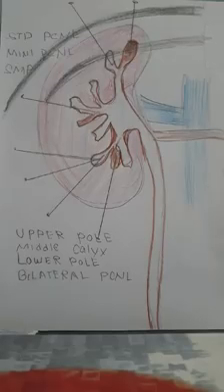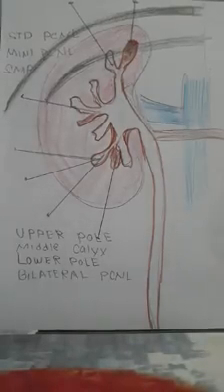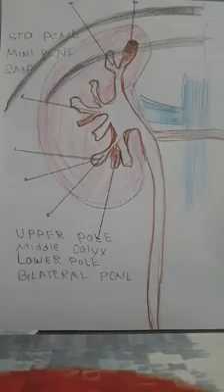I used to do standard PCNL when I was training. We used to use a 26 French scope and a 28 or 30 French sheath. Eventually, my standard PCNL now is a 21 French scope and a 24 French sheath. That's my standard in practice now.